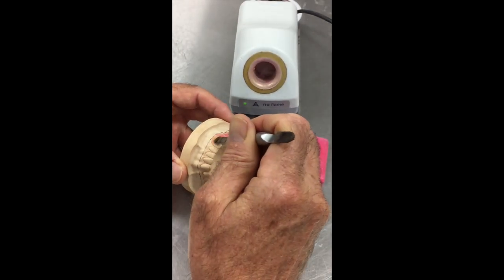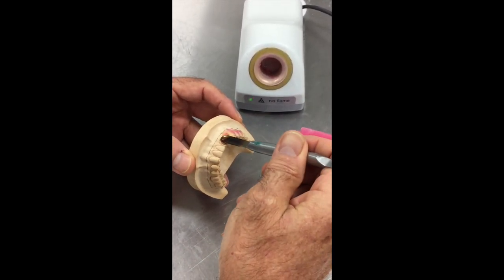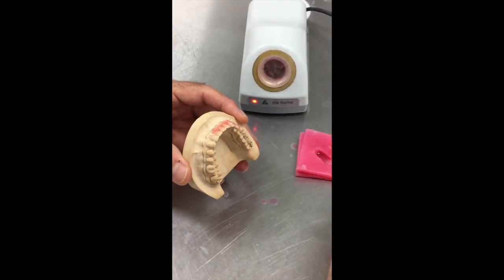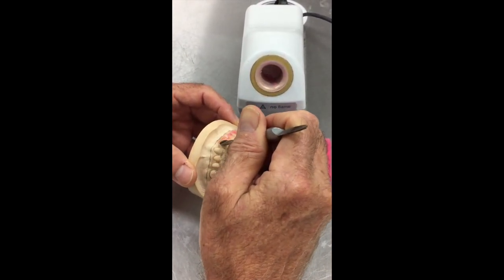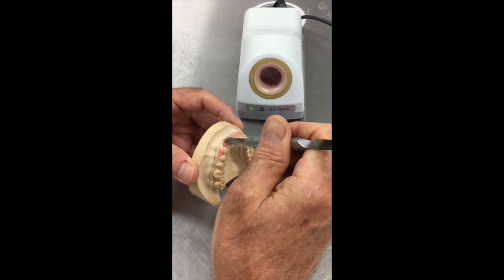And we don't need to get caught up in the neatness of this, because it's only a spacing material for the impression, to provide a space for the impression material and to allow it to flex out of undercuts.